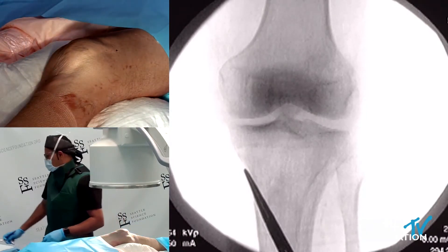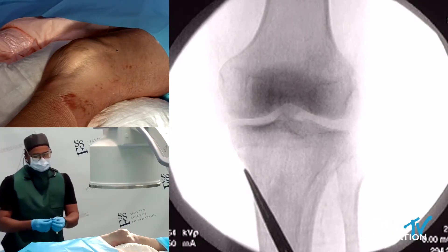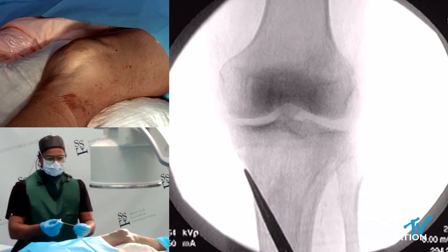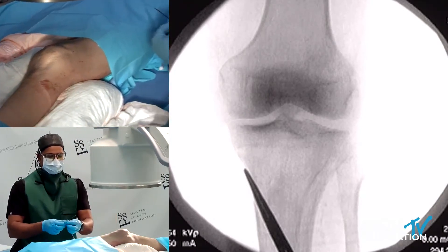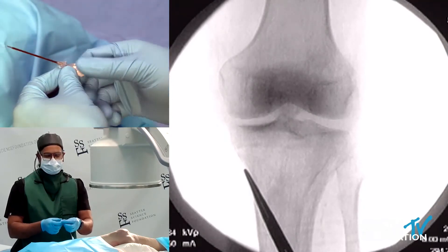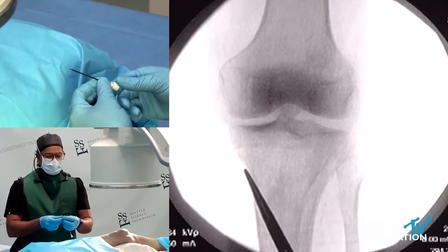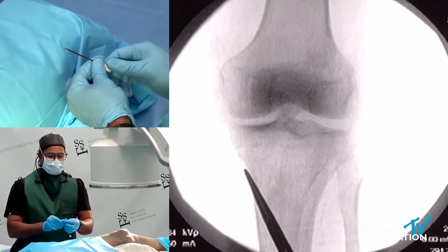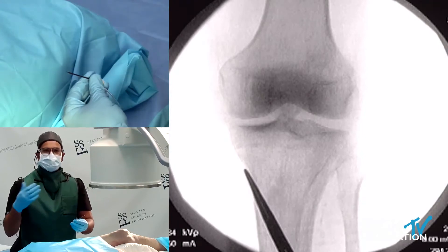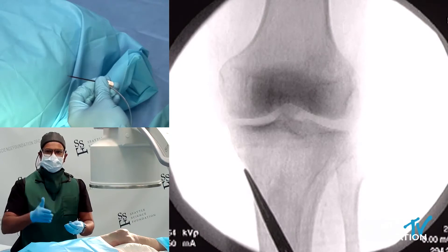Some key things here with the cooled radiofrequency procedure — a little history from Bayless to Halliard to Avinos. They really brought this technology to the pain management space. This technology has been used in cardiology for radiofrequency ablation for atrial fibrillation, and in cancer oncology care for ablation of tumors. And now we're using it to create a moderate and modest amount of damage to the nerves so that we can block nociception.